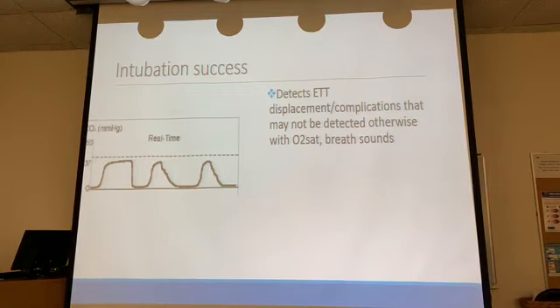It's going to move out of place some more, and now all of a sudden you're going to think, well, it was in the trachea, I don't know what's going on, maybe it's suctioning in, but you're out of place. So that's very useful, because there's nothing else. You don't have a chest x-ray, you don't have anything else that can tell you this, so keep that in mind.